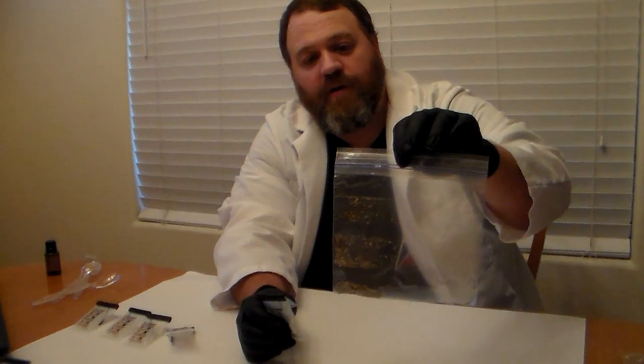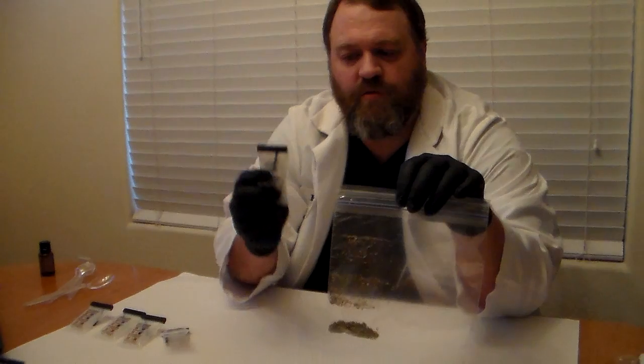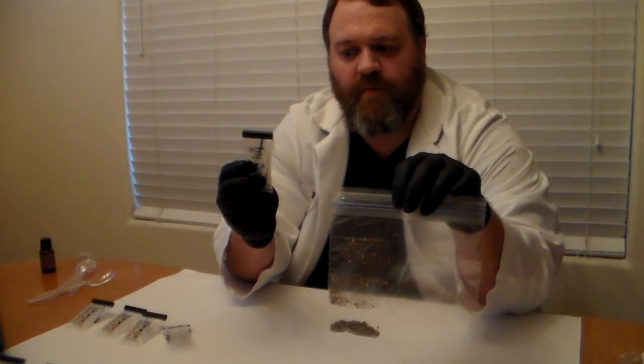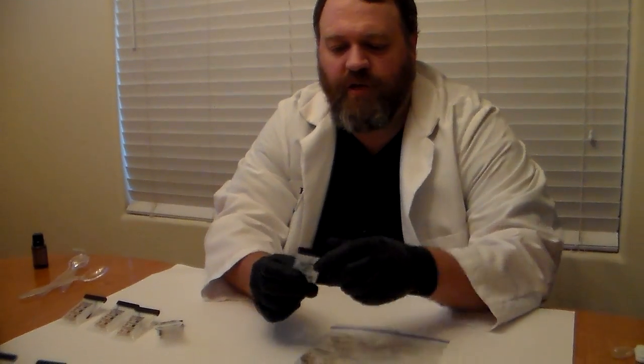If you look at the front of the packet, we're actually going to break the vials from left to right — the one on the left first, then the one in the middle, and then after we shake it, we'll break the vial on the right last. So what we're going to do is add a little bit of our sample. What we have here is a bag of green plant material — a bag of marijuana. We're going to add a small amount to our envelope and then expose it to the chemicals and hopefully see a chemical color change.